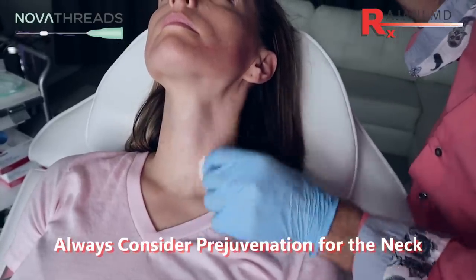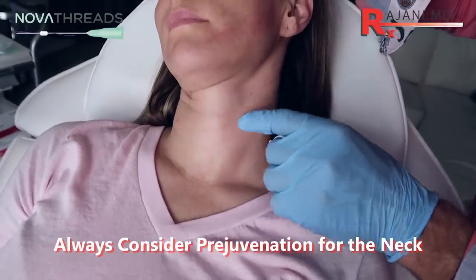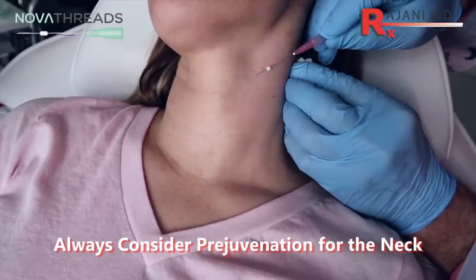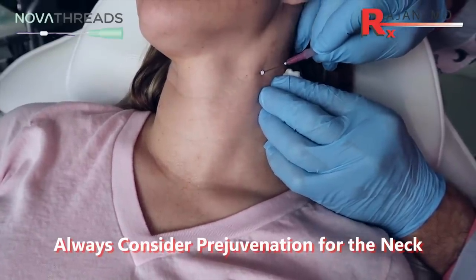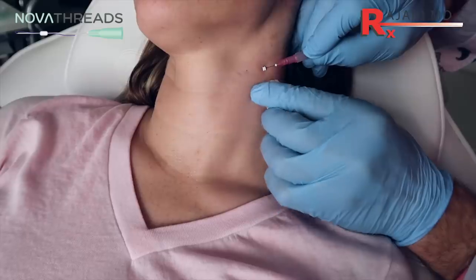We'll cleanse the skin here. We're going to treat the neck region — I get a straight plane. Tilt your chin down so we can see where the line goes. So we're going to start up here and course down this one. These can be used with deeper lines; in this case we want to minimize them and prevent them from occurring, so we're supporting them.